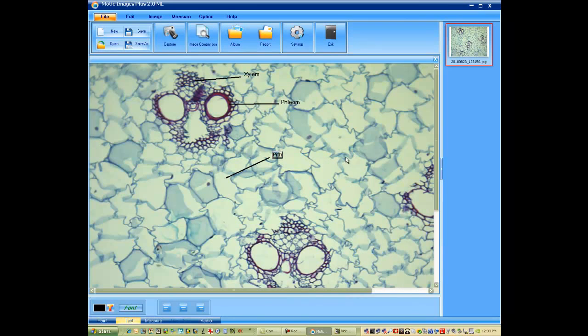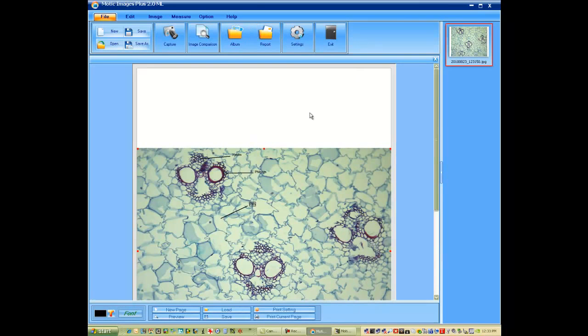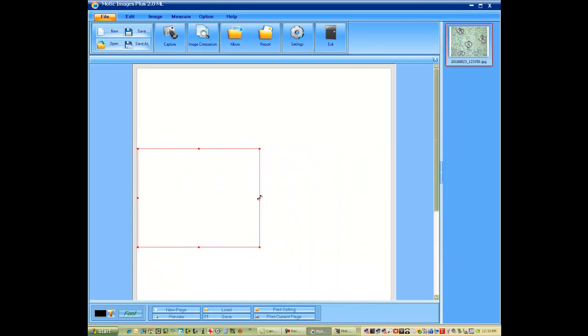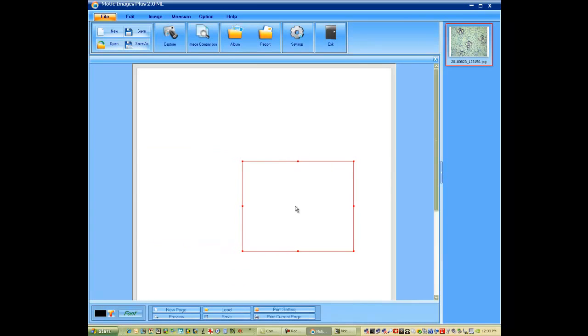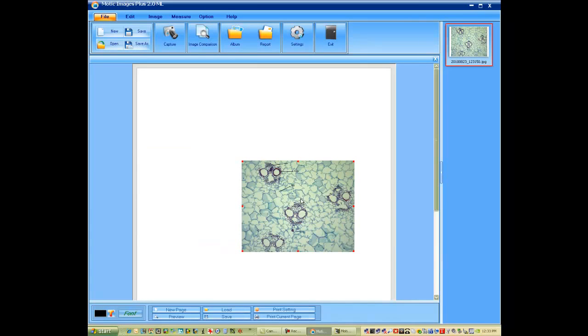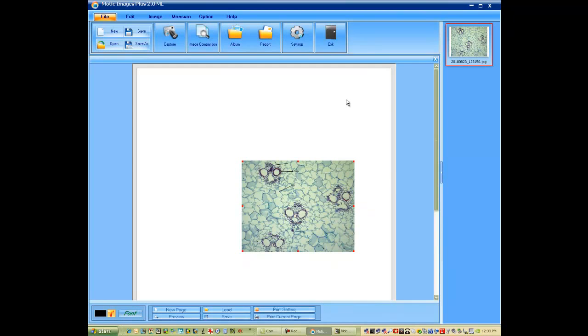Once we've finished with that, we can now save the image or we can import it into our report format. And by doing so, now the students can make a report out of this. Again, your text tool and your font characteristics. We'll make this bold and a little bit larger for our title.